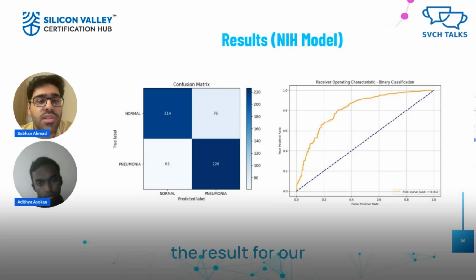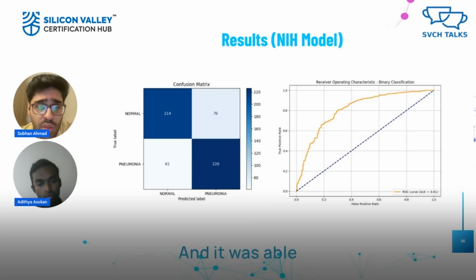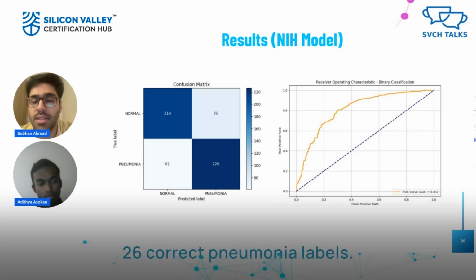And then this is the result for our NIH model, the data from the US. It showed that it performed well, but not better than the China data set. The AUC value was 0.81, and relatively it did pretty well in terms of being in the top left side of the whole graph. It was able to predict 214 correct normal labels as well as 226 correct pneumonia labels.